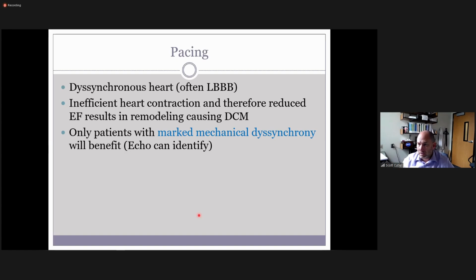Back in the early 2000s, when I was scanning in Colorado Springs, we worked with a pacemaking group, so they did the pacemakers. Those implanted pacemakers, they have this wand hooked up to a computer that they put over top of the pacemaker, and that's how they change the settings. It's really kind of cool. And we used to do Dopplers, like a mitral inflow Doppler to look at how the function is. And we'd use M mode to look at the timing of the septal wall to the posterior wall, and they would be off. They'd be squeezing at two different times. They'd be dyssynchronous.